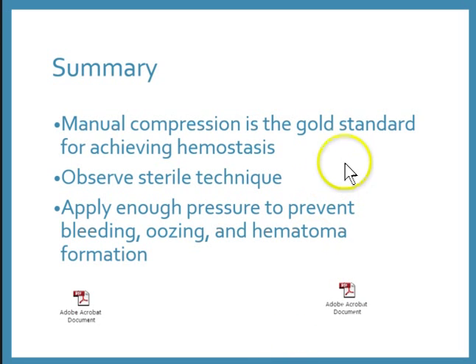All right, so in summary, manual compression is the gold standard for achieving hemostasis. Make sure that you are using a sterile technique, and you need to apply enough pressure to prevent bleeding, oozing, and hematoma formation.